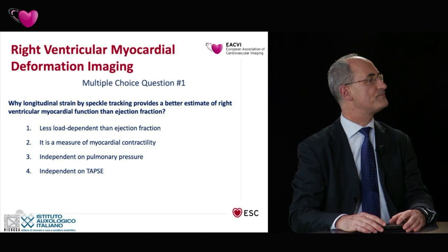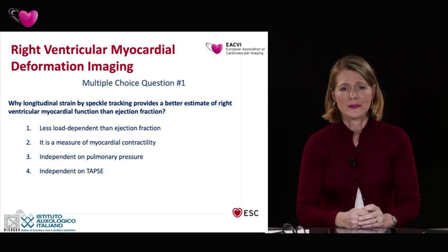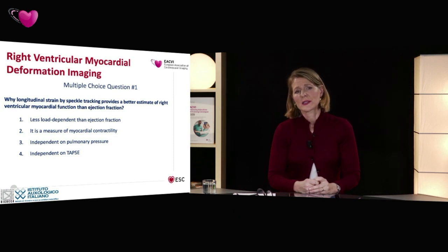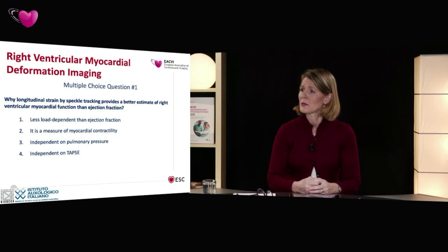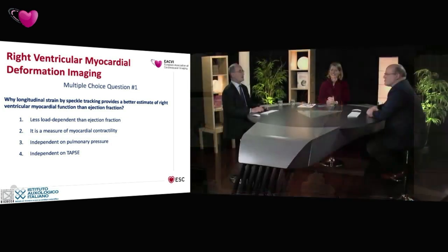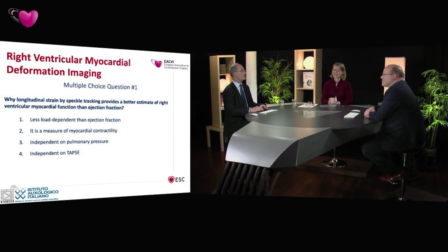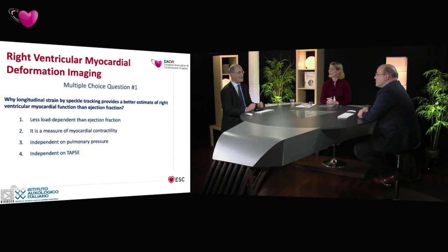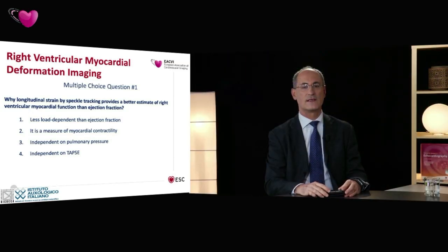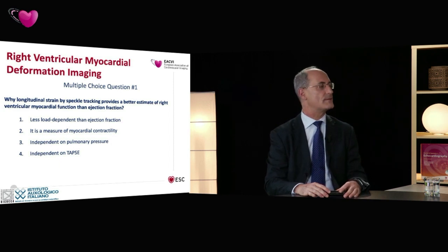Make your choice. Very nice, Luigi. In the meantime, maybe all these answers might be a possible option, but you are convinced that there is one correct answer. Yeah, they may be possible options, and I have put them in a little tricky way in order to challenge our friends, because one is the really correct one. The others are possible, but we can discuss that.